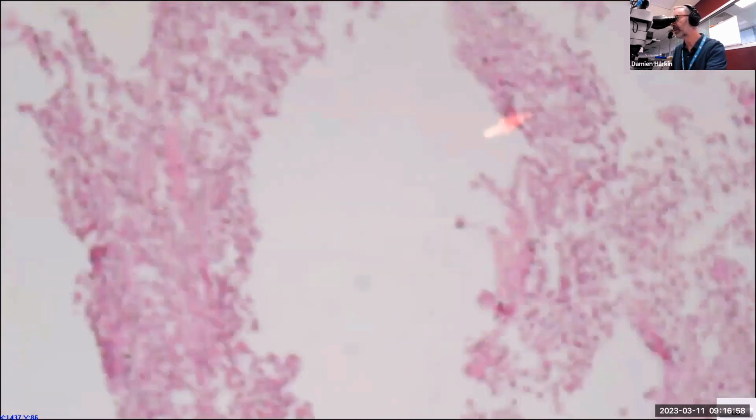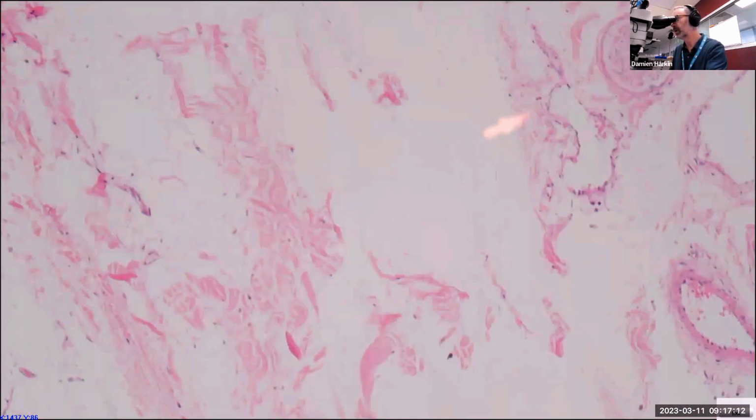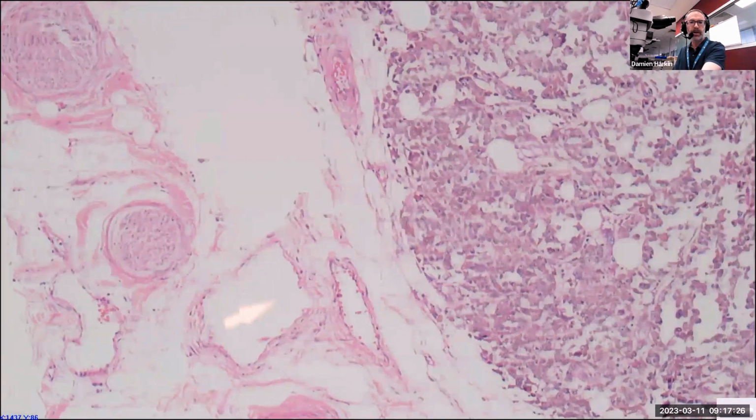My apologies, I've got it around the wrong way. I'll bring that down here, just to show you some markers for an area that we can come back to on the other slide. So we can see here there are some prominent nerve bundles within this extracellular matrix. And then over here, we've got the melanin, so we can just focus in on that.